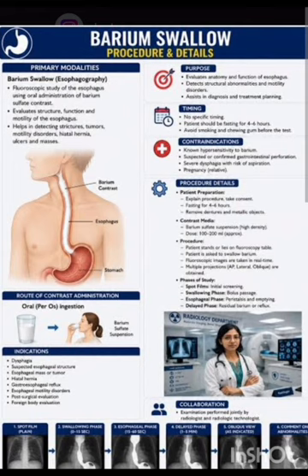Then we will move on to the double contrast study. In double contrast study, the patient is placed in an upright position, then an injection of hypotonic agent Buscopan or glucagon is given to the patient. After the injection, one mouthful of high density barium sulfate is given to the patient and asked to swallow. The passage of barium is observed by the radiologist under the fluoroscopy machine.